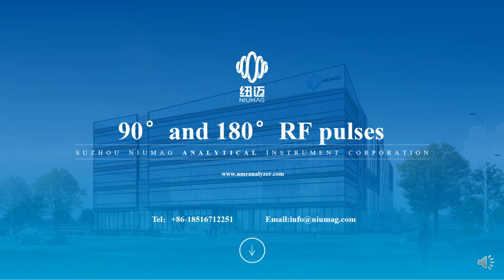Hello, everyone. Today we will talk about the 90 degrees and 180 degrees RF pulses in MRI sequences. There are different forms of pulses in MRI sequences, and the 90 degree and 180 degree RF pulses are two pulses that are very commonly used and very important. It is necessary for us to understand them separately.